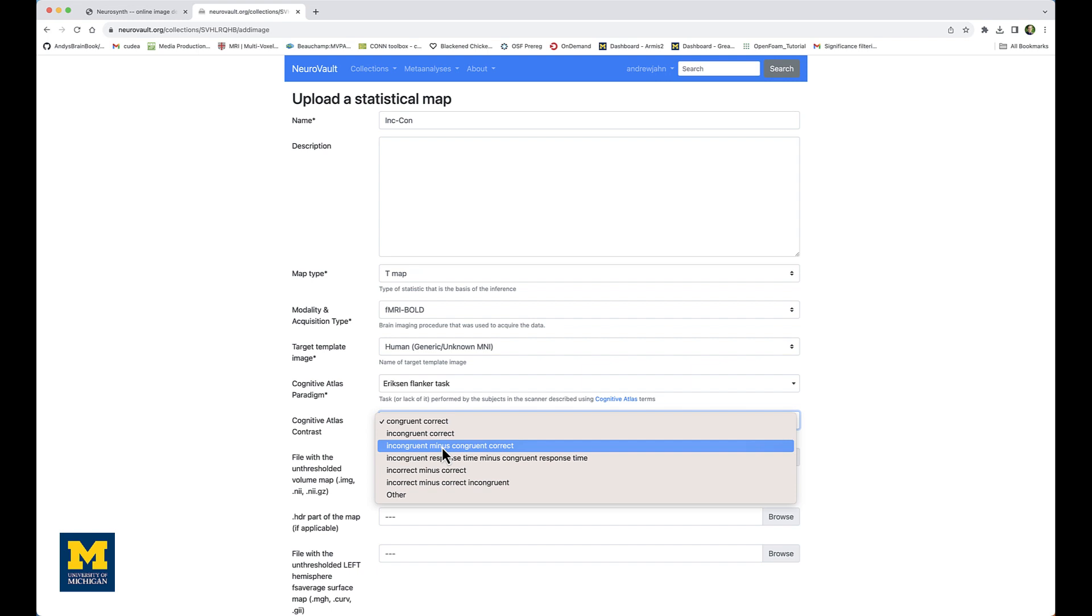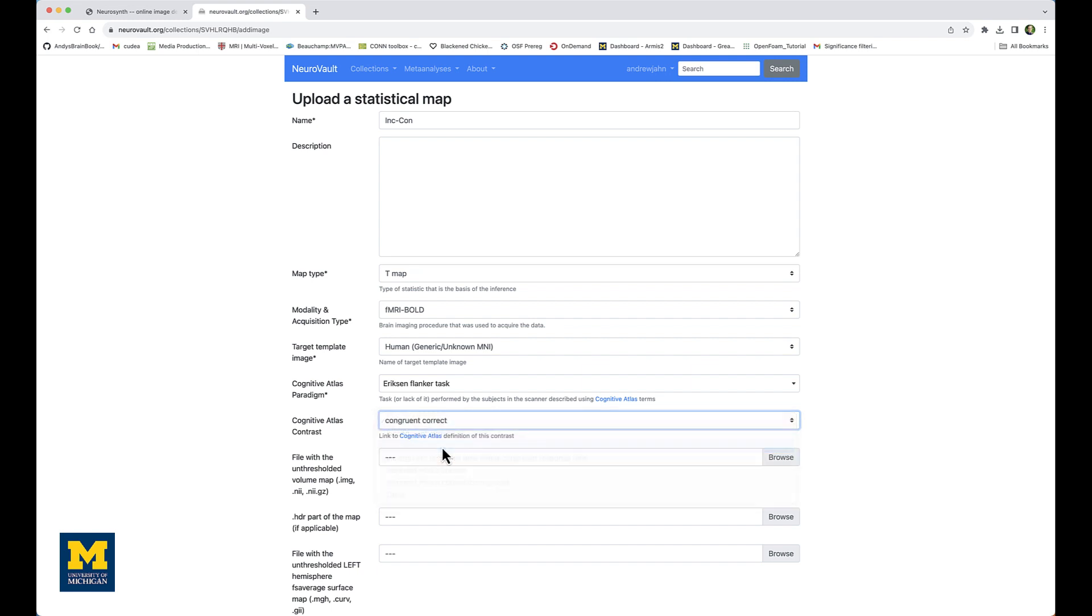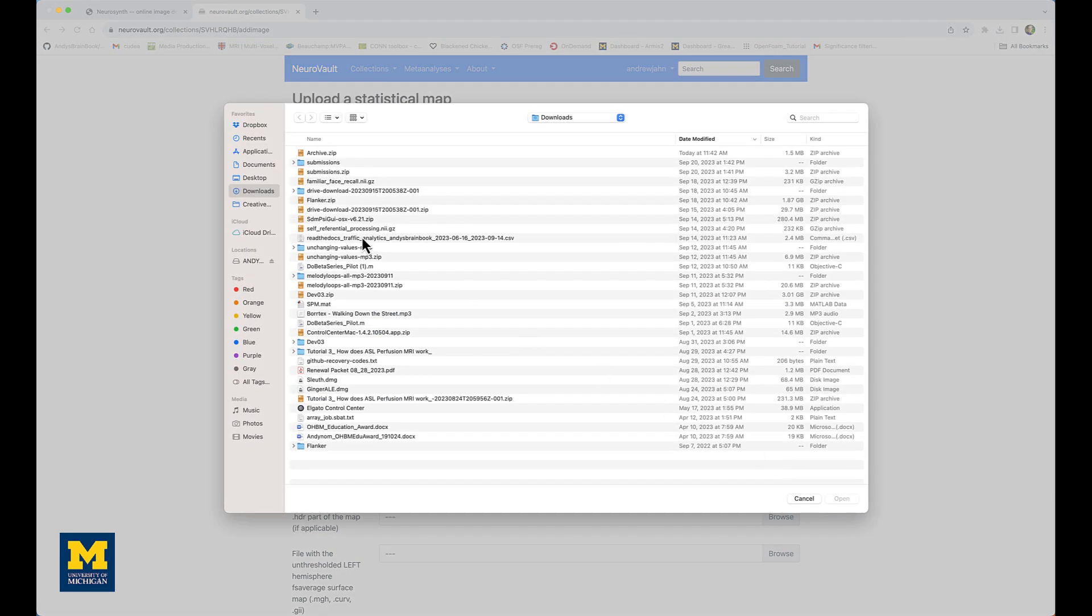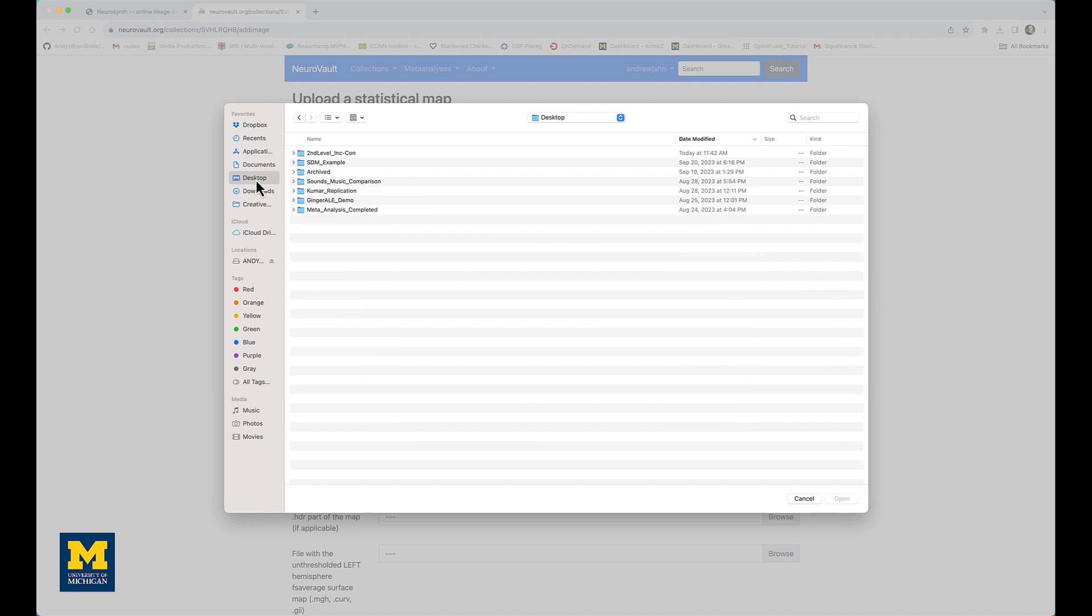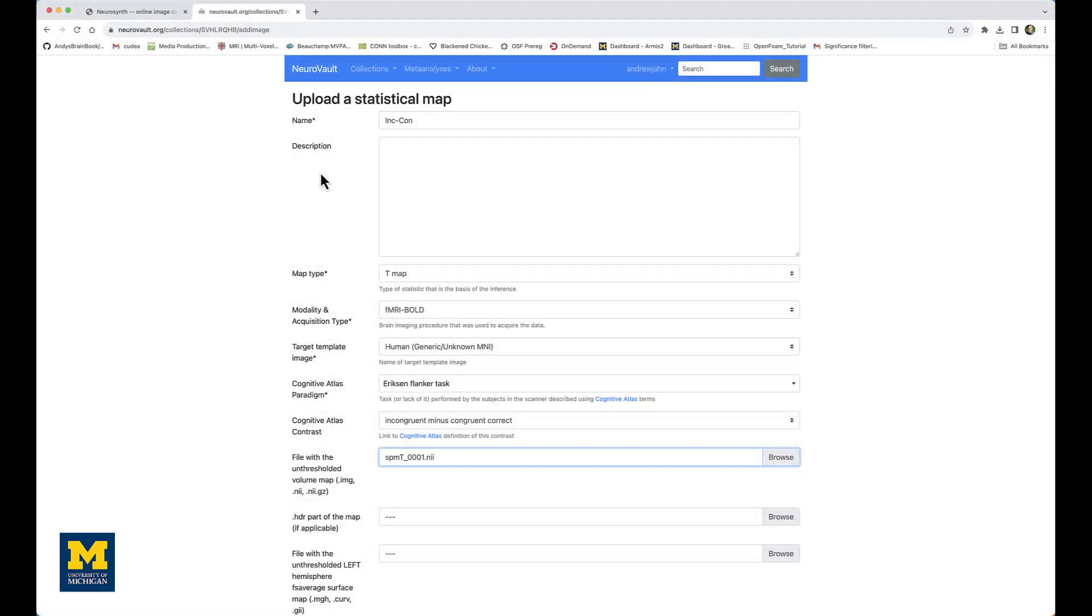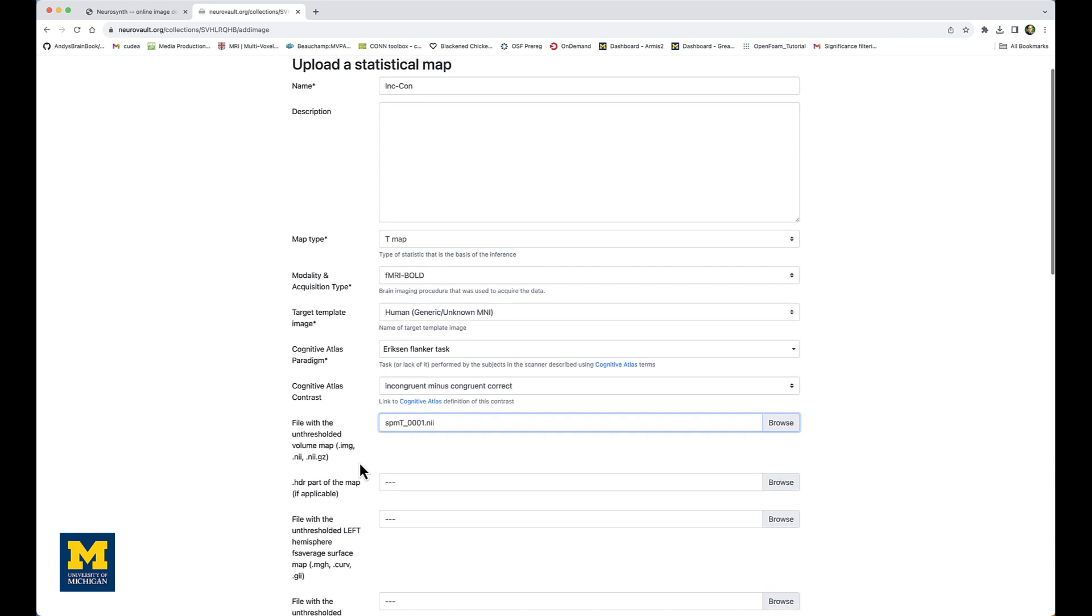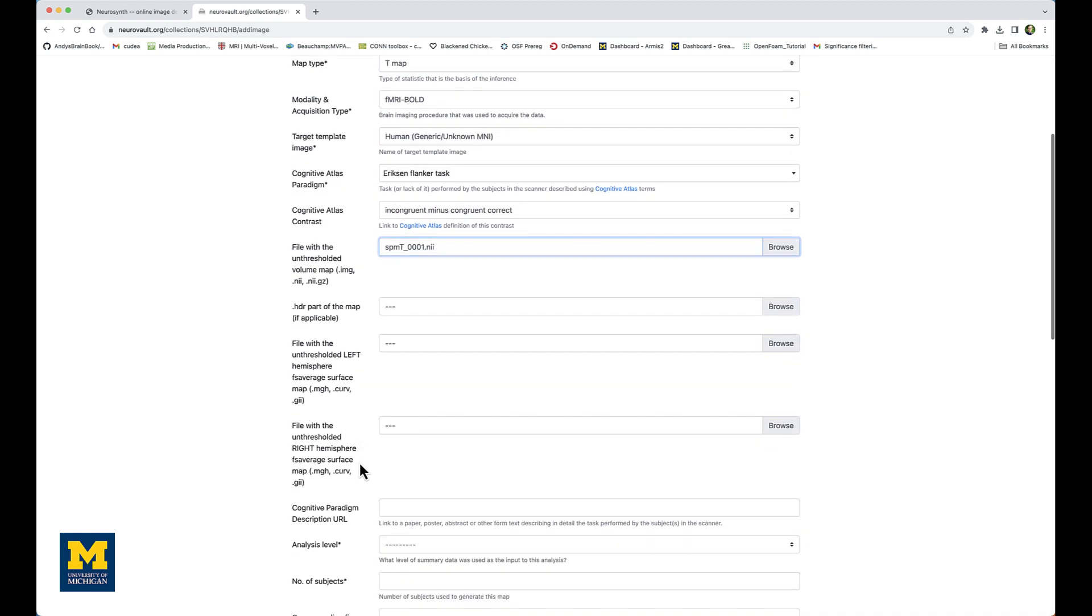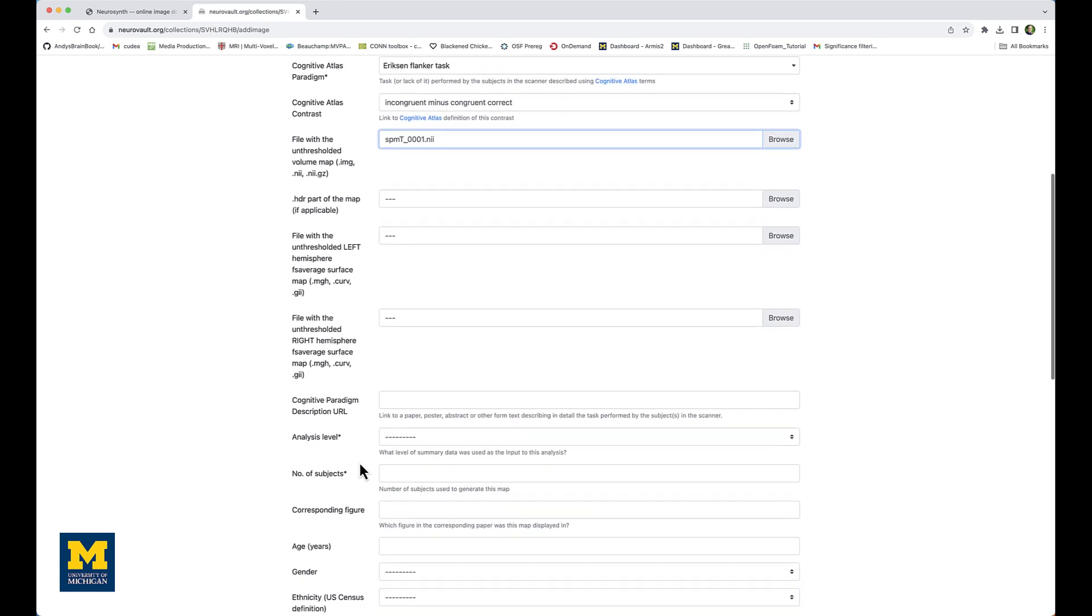So I'll click on that one. We then select the unthresholded volume map by clicking on the Browse button. And in my case, this is a folder on my desktop directory which is labeled second level inc-con. And within that directory, I select the spmT_0001.nii file. There are many other options that you should fill in if this is for a published study and you want to include as many details as possible.